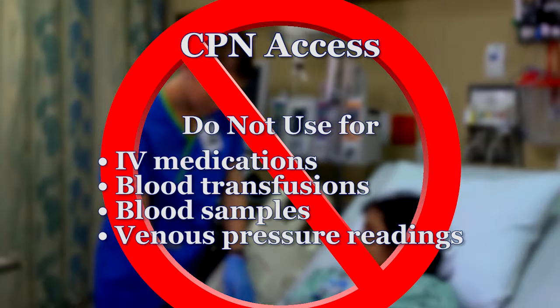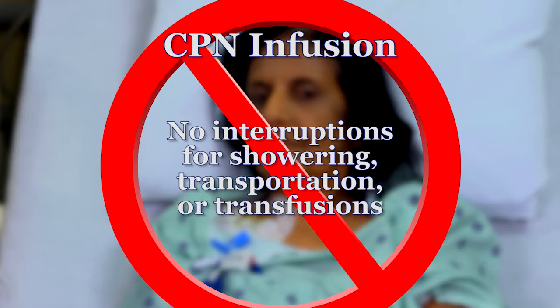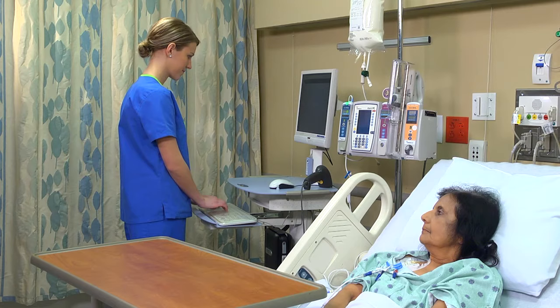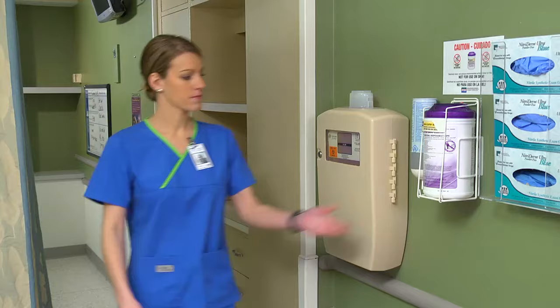In addition, the CPN infusion shouldn't be interrupted for routine patient care or procedures, such as to give the patient a shower, transport her to therapy, or administer a blood transfusion. Once you've completed all required care and discarded your used supplies, remove and discard your gloves. Then document the patient's tolerance of the procedure. Perform hand hygiene as you leave the patient's room.